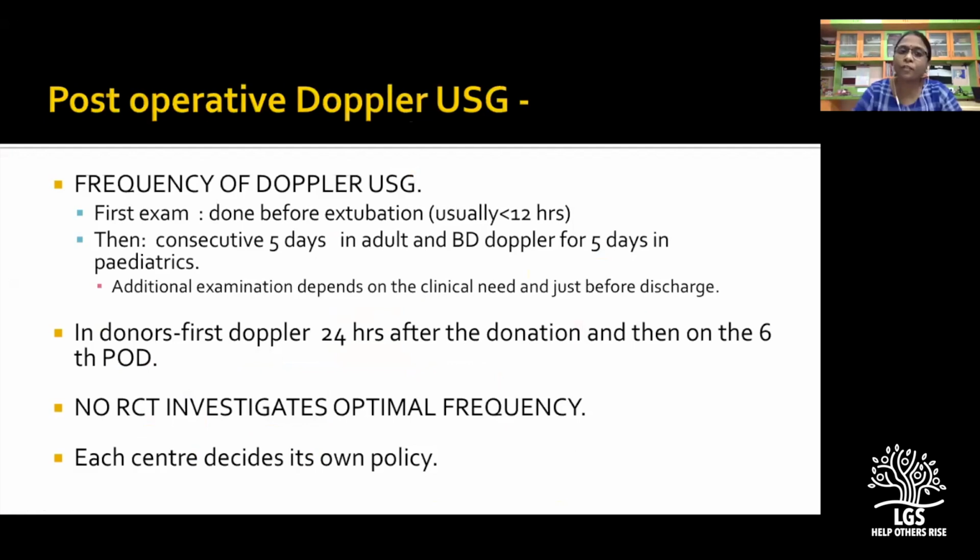And postoperative Doppler, usually in our unit, the person who is doing the intraoperative Doppler will also do the first postoperative Doppler before extubation. If it is not possible, and if the person is going to do the postoperative Doppler for the first time, it is very essential to have a review of the intraoperative notes. We have a white card which tells us the details about the surgical anastomosis and the major events that happened in the surgery related to the imaging. After having that knowledge, we have to perform the postoperative Doppler.